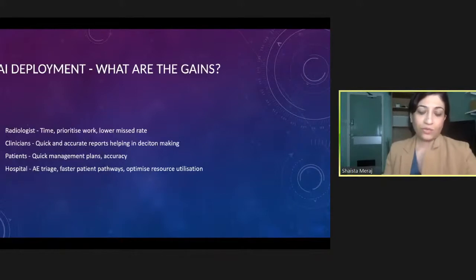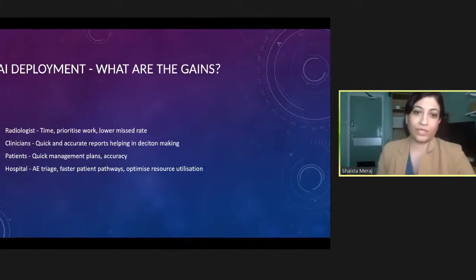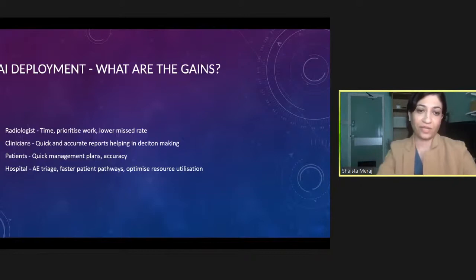So what are the gains? For any AI radiology deployment, we can ask, what are we getting from it? So from a radiologist's perspective, a good AI solution will save time and do the tasks which are time consuming. It can prioritize our work and highlight potentially positive cases. It helps us to pick up findings that can potentially be missed. For clinicians, it should produce quick and accurate reports. For patients, it would be good to have quick treatment plans, and the hospital would benefit from having faster patient pathways and maximum efficiency in resource utilization.